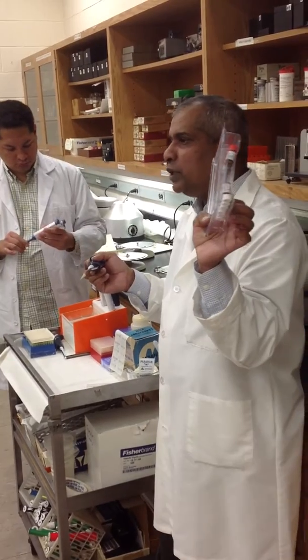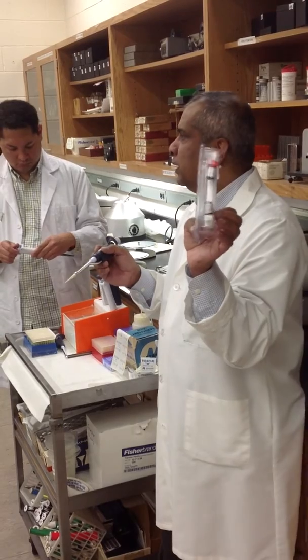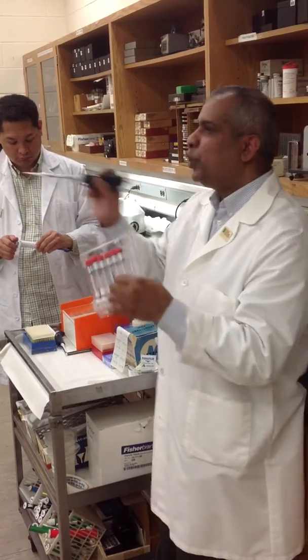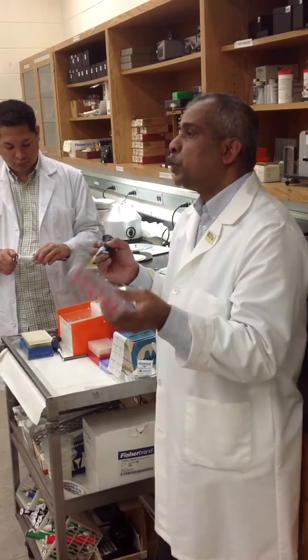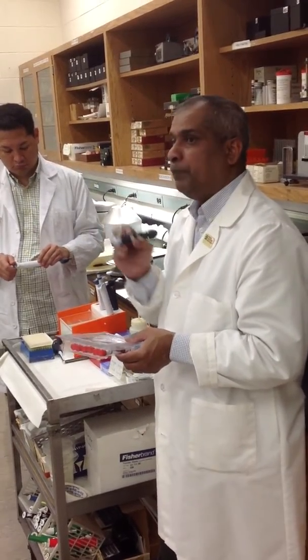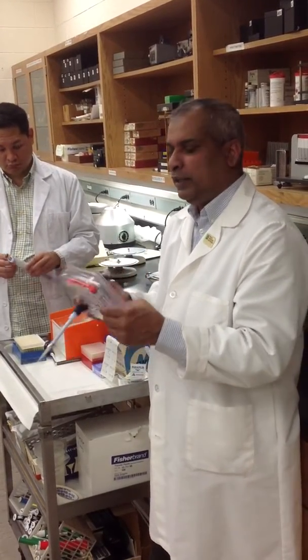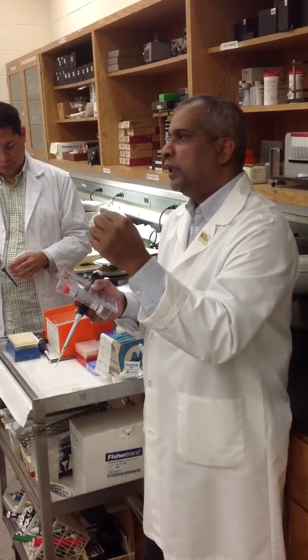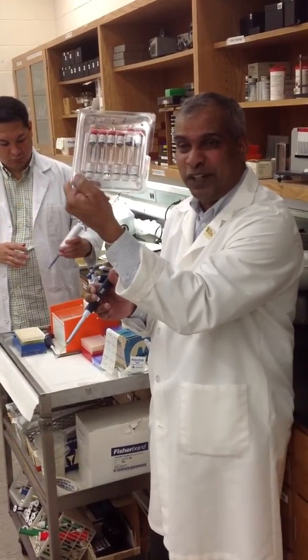So these we know when we buy them, the insert gives us the answer, what the counts are. So it's extremely accurate. When you count, your number should come very closely to match what they're telling you it is. So these are used in some of our cell counters for doing a CBC, the blood machines. And we use it as controls. So in the morning, you warm this up, take one out, and put it on the machine. It needs just a little bit only, right? And we will do the test and spit out all the results, and it should match this.